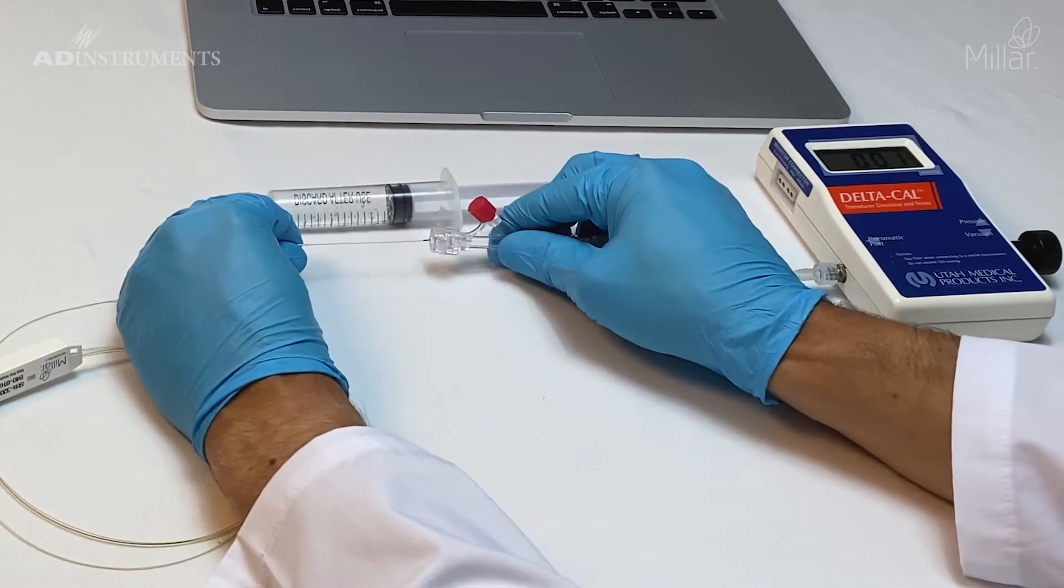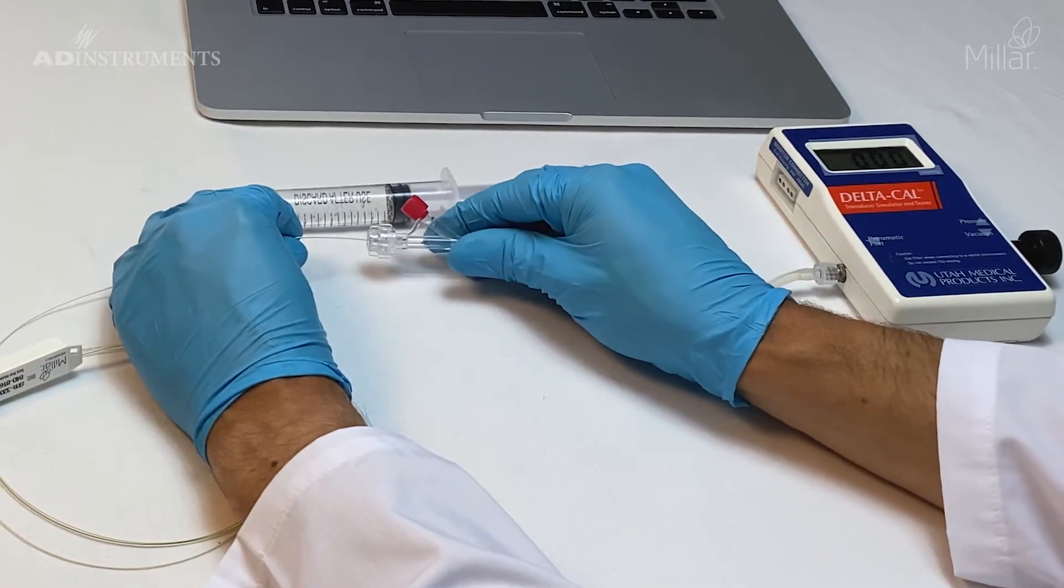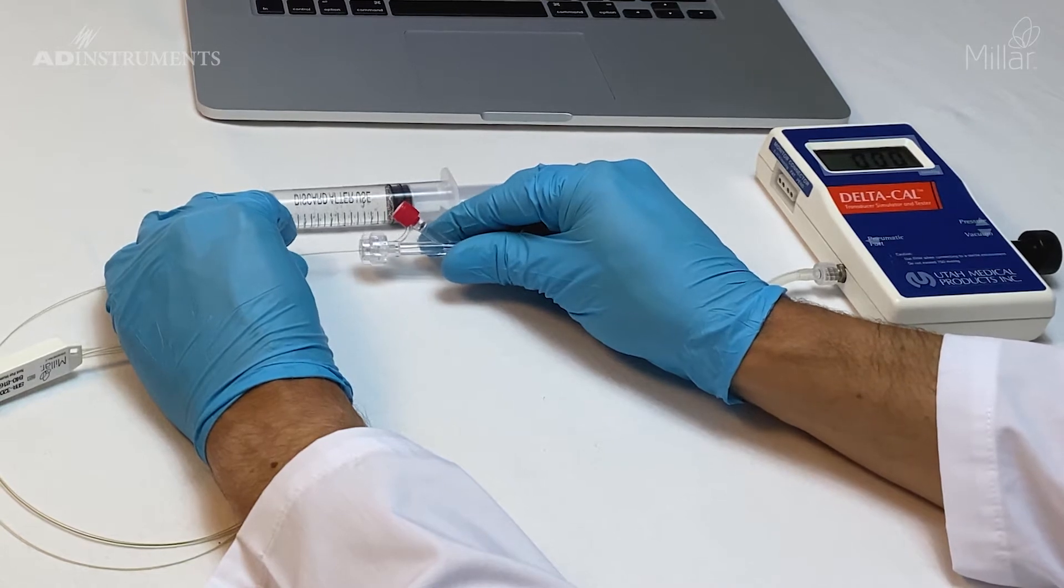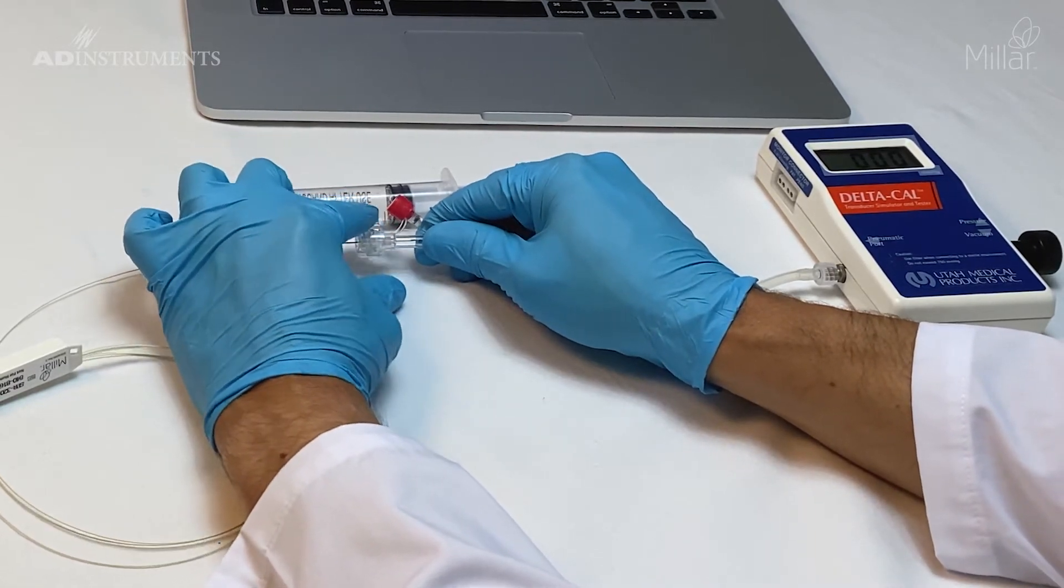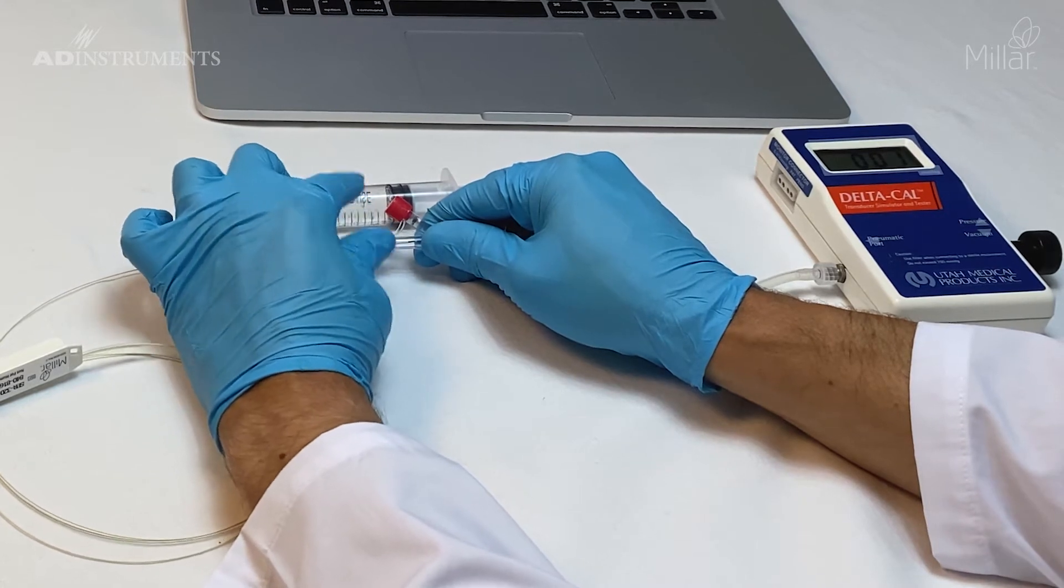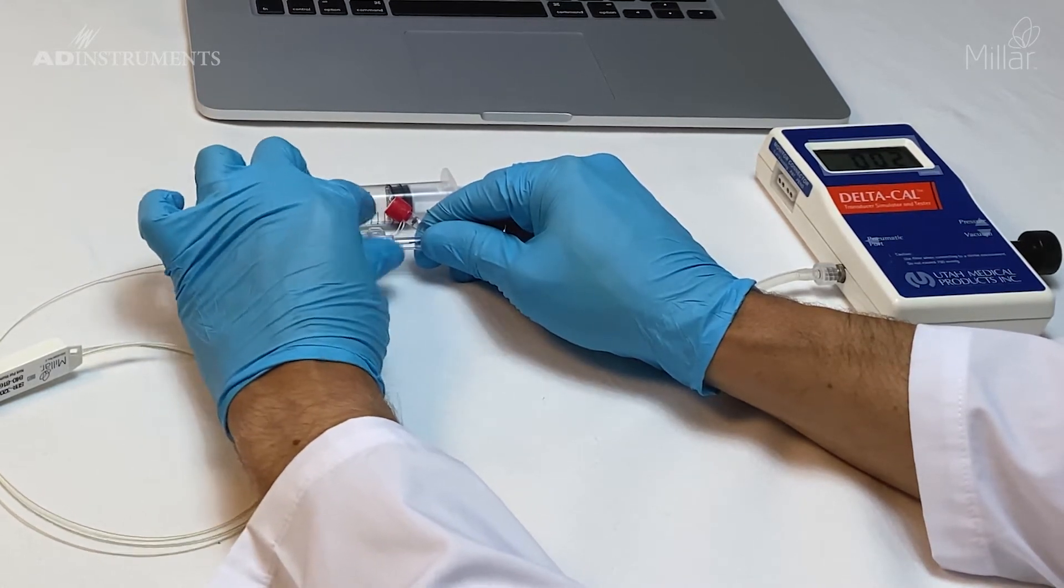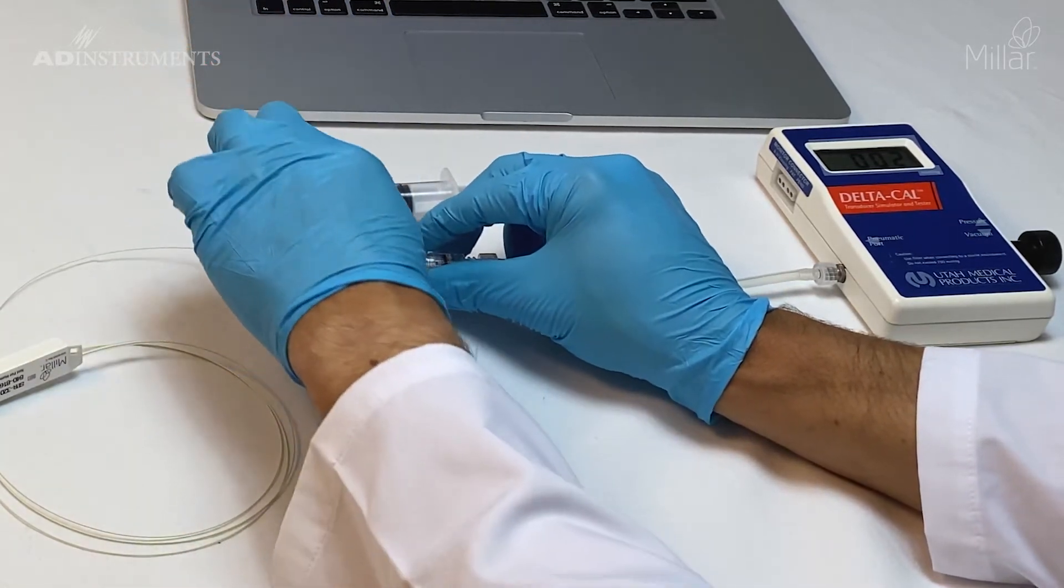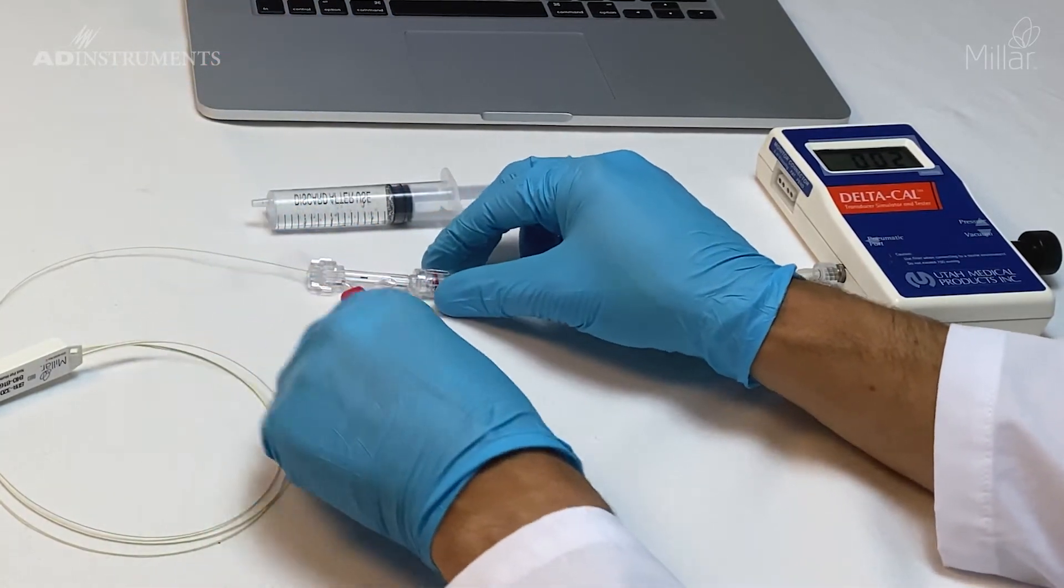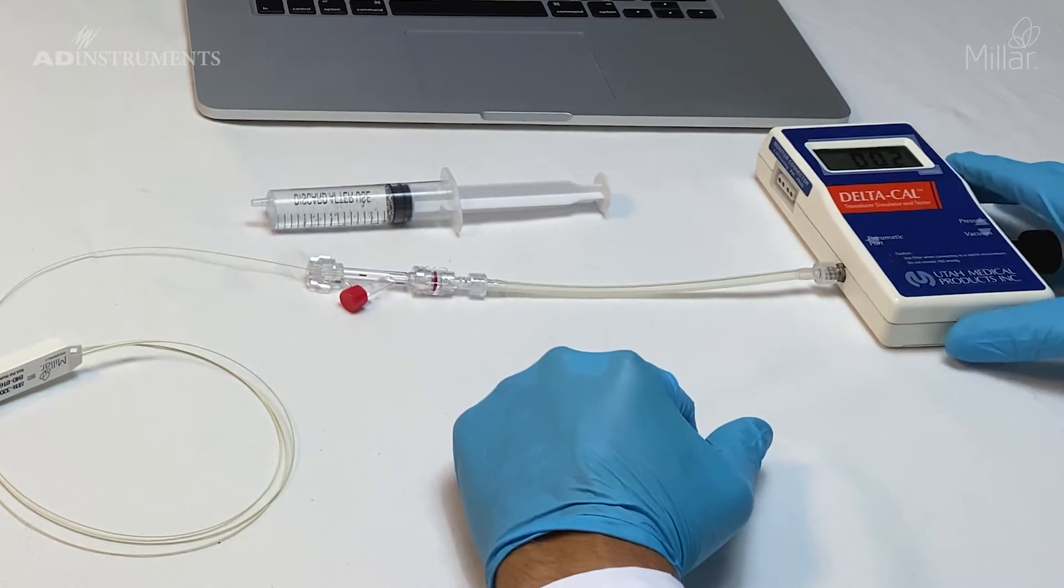I'll take the catheter and insert it inside the valve so it's in the fluid, then close the valve just enough to seal around the catheter. Now the catheter is inside the hemostatic valve.